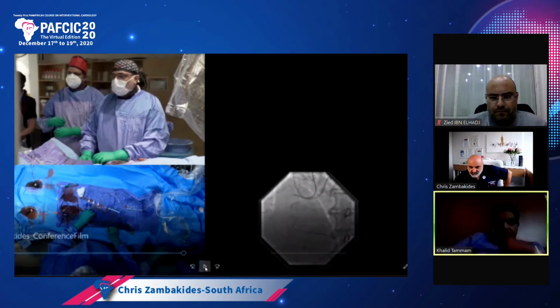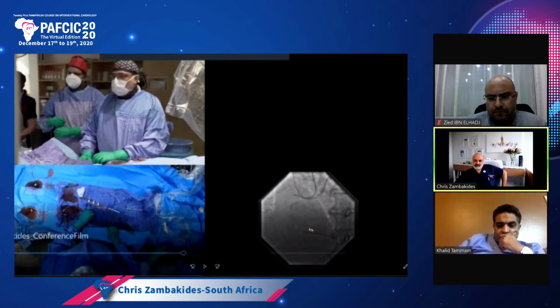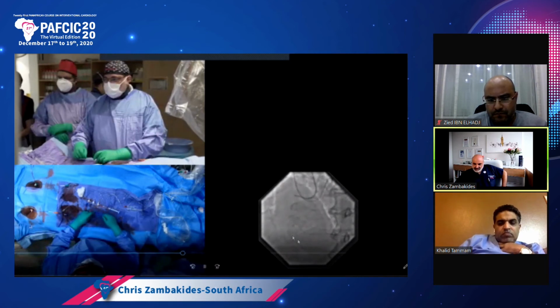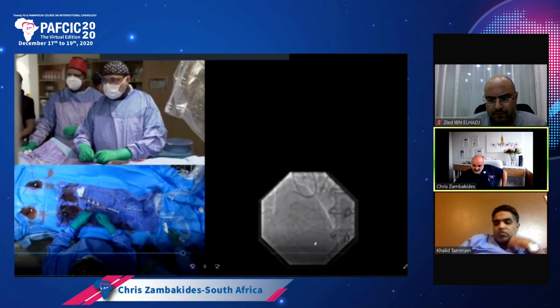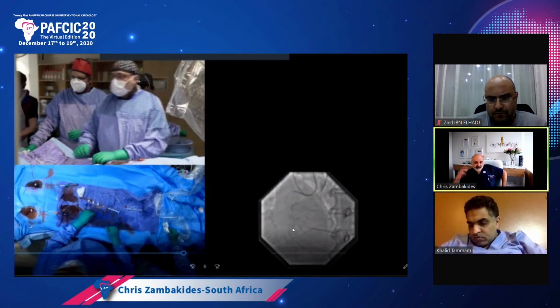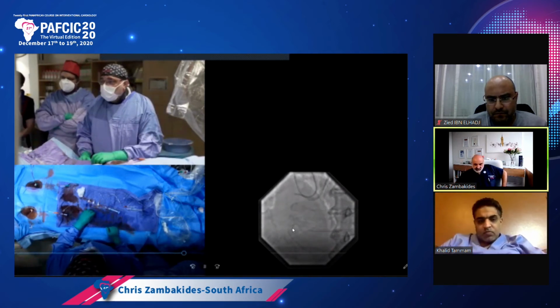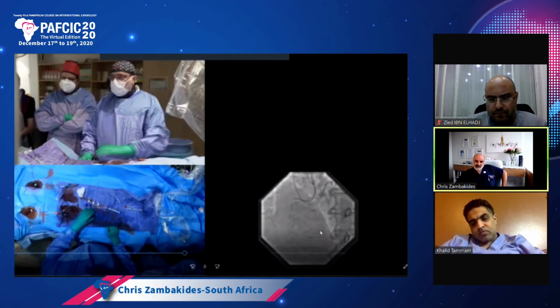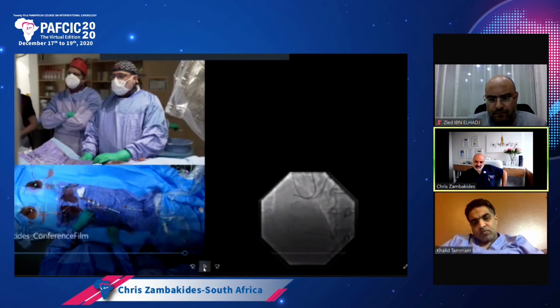Okay. So you can see that the microcatheter appears to be in the stent, but when we take out the Gladius and it knuckles, you can see that it actually forms a very small little knuckle, but it's outside of the vessel. You can see that it's not following the stent. The stent that Dr. Dawood must have put in was undersized. We actually thought that our wire had gone through the stent, but the wire was actually outside the stent. So what we need to do now is redirect.